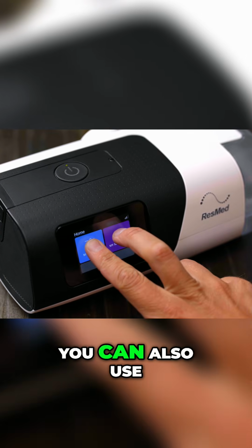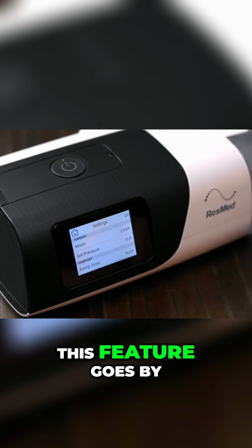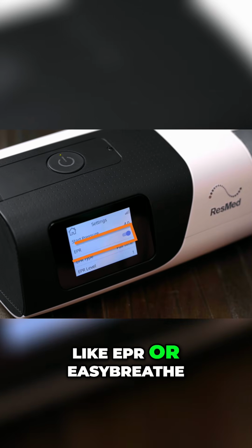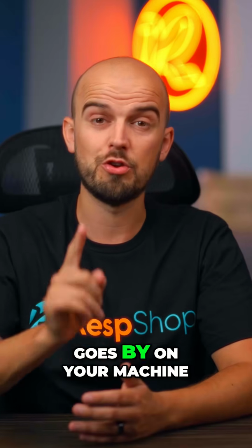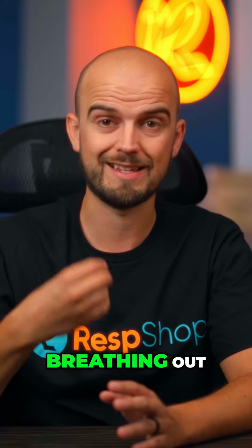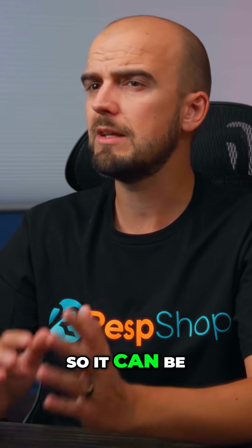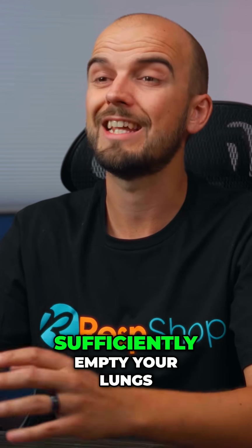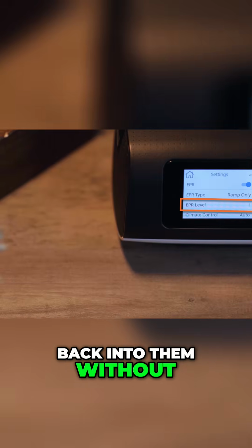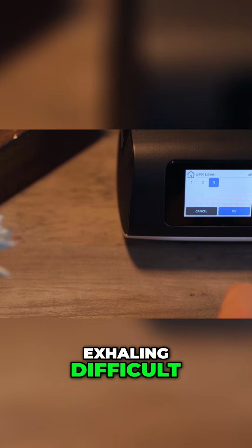Separately to this, you can also use pressure relief settings on your exhale if your machine allows it. Now, this feature goes by various names depending on your CPAP brand, like EPR or Easy Breathe. But by whatever name it goes by on your machine, it will drop the pressure when the therapy algorithm detects that you're breathing out. The level of drop will depend on the setting that you put for this, so it can be tweaked to make sure that you're able to sufficiently empty your lungs and then have the capacity to breathe air back into them without swallowing it. So increase the relief setting if you find exhaling difficult.